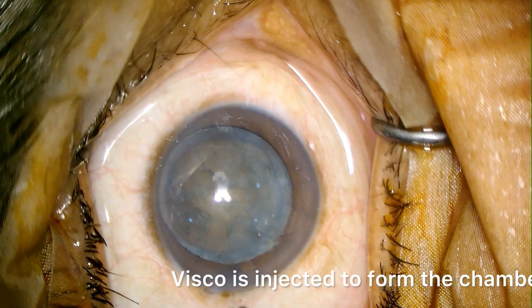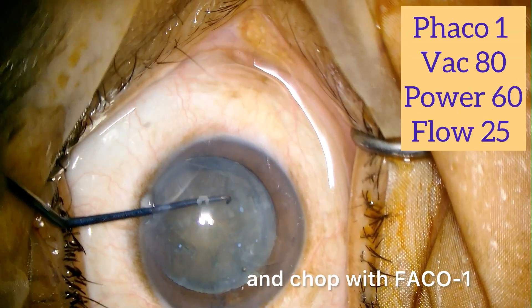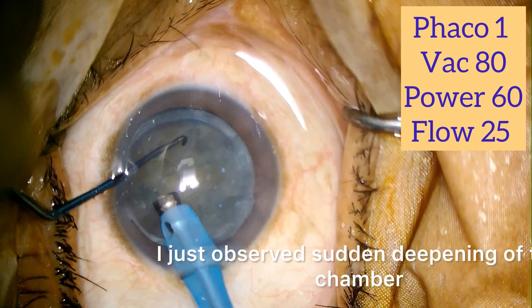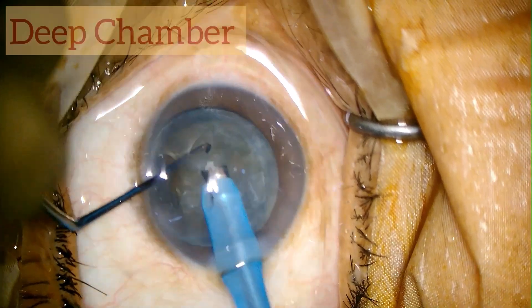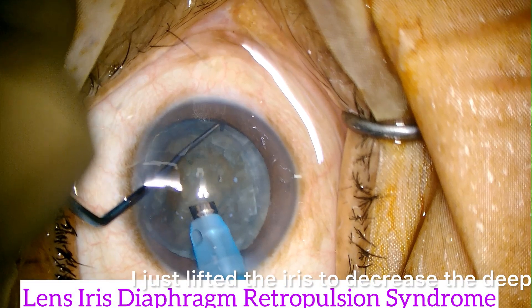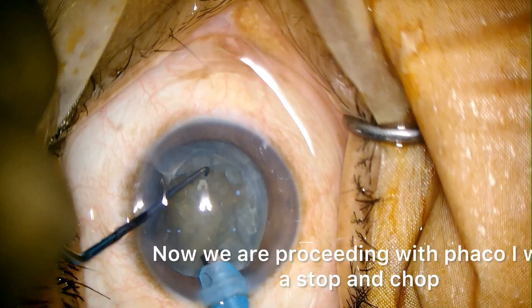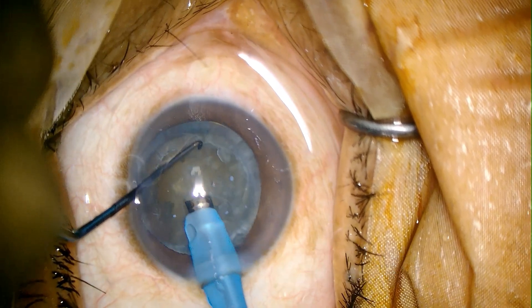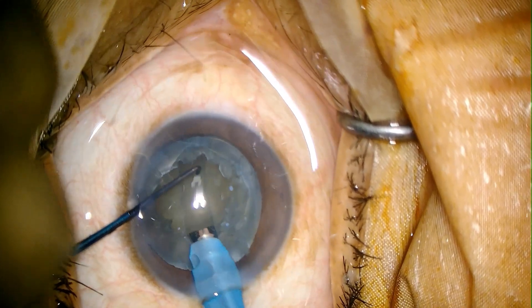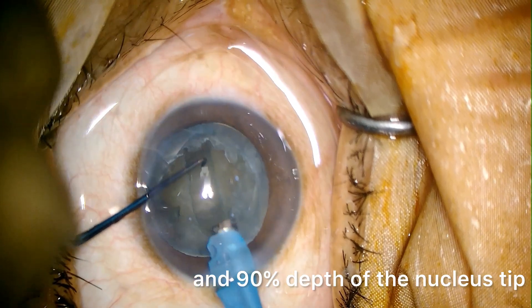Visco is injected to form the chamber. Now we are doing stop and chop with phaco 1. As I entered into the eye I just observed sudden deepening of the chamber. Considering LIDRS syndrome, I just lifted the iris to decrease the deepening of the chamber. Now we are proceeding with phaco 1 with a stop and chop, making the tunnel — one and a half width of the phaco tip and 90 percent depth of the nucleus.